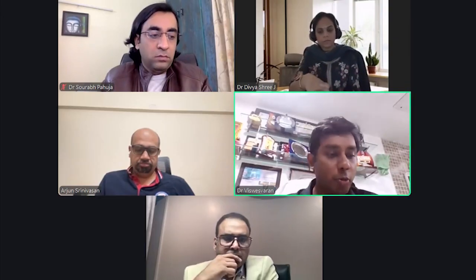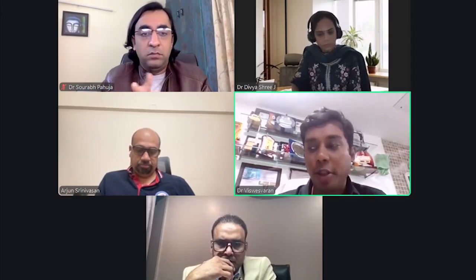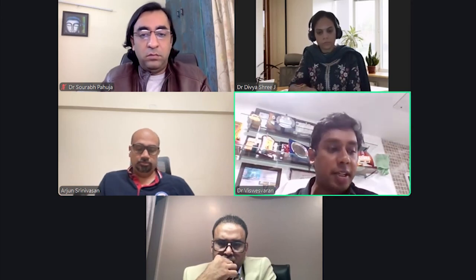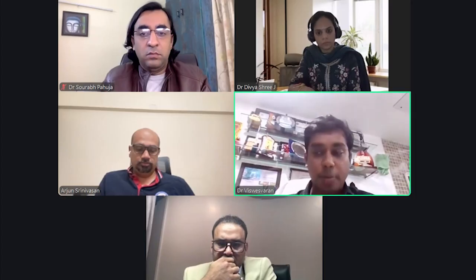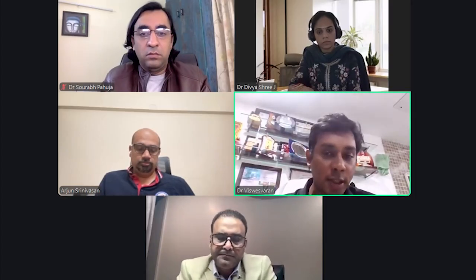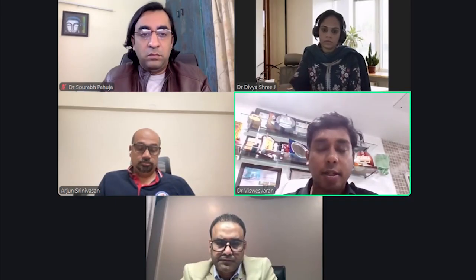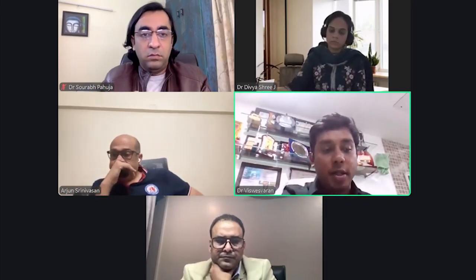Yeah, so very good points, Divya. The primary thing is that when you are considering a benign lesion, generally you need to consider the possibility of surgical resection. So most of it is with curative intent. Whereas when you deal with a malignancy, as you said, it will be more of a palliative intent. So interventional pulmonology becomes a primary modality in terms of malignancy, whereas surgical modality takes precedence in terms of benign disease wherever it is possible. So now moving on to Dr. Arjun sir, are there any absolute and relative contraindications for using hot therapy in clinical practice?